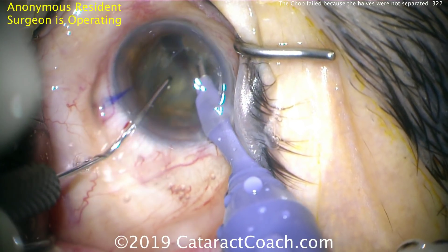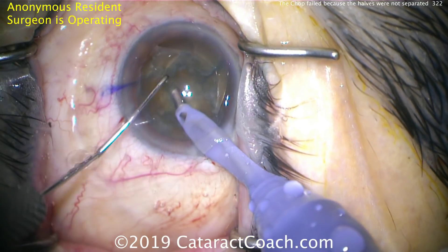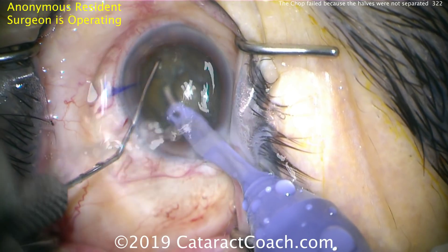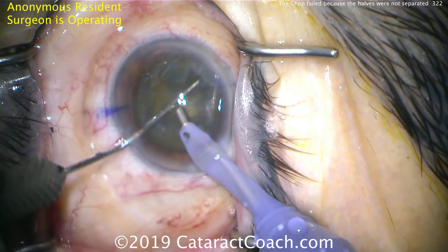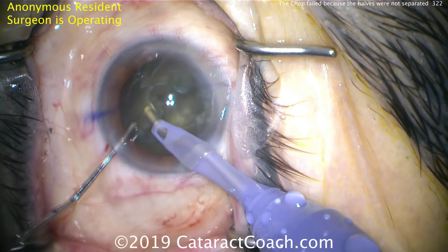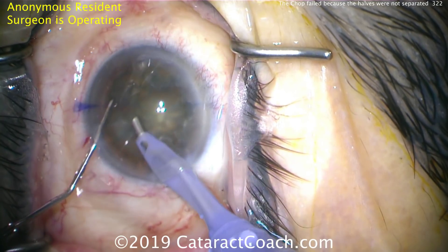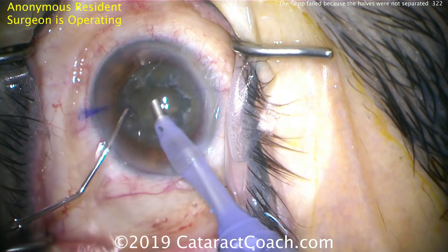I'm going to show you what becomes a danger here: you'll thin out the nucleus too much, and there's less tissue to grab onto. Buzzing in with the phacoprobe, that looks pretty good, but it didn't hold enough because it's still attached. Now look at the central nucleus — it's just hollowed out. We've bowled out the center of the nucleus; there's not a lot of tissue to grab onto, and that's going to make it very difficult and challenging.